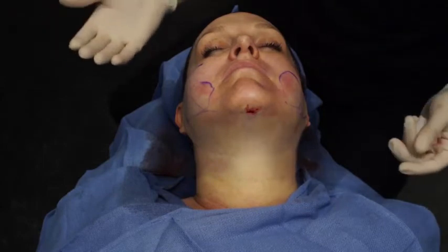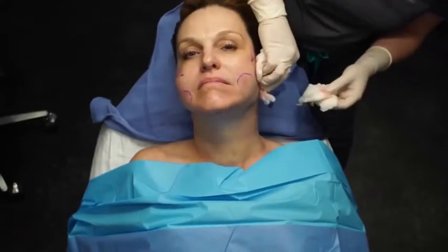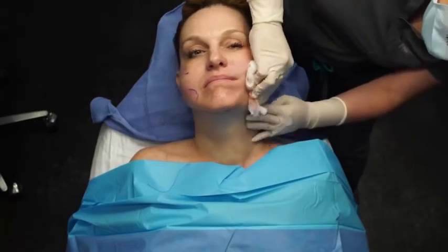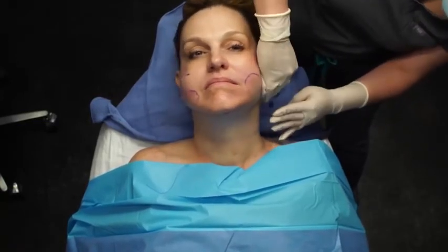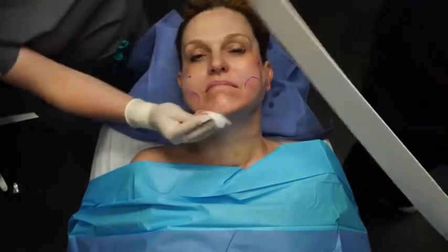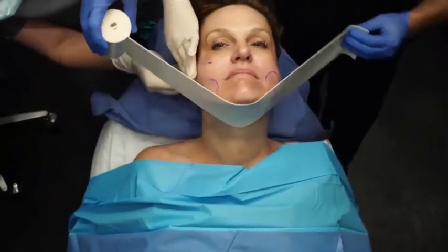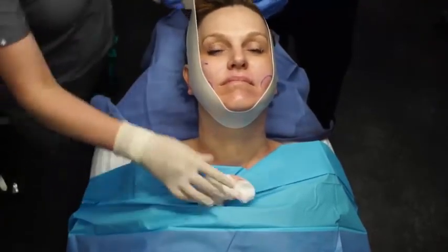Tomorrow she'll look pretty impressive. We're going to go ahead and do a little bit of gas egress, that last little bit of massaging to get any residual gas out. She did have 250 cc's of tumescent, of Klein solution, and so you will see some periauricular tumescent there, and then distally here. And then we're going to use a latex-free foam. Chin way up for me, hun. We'll use this to bandage and help compress some of those edematous areas.